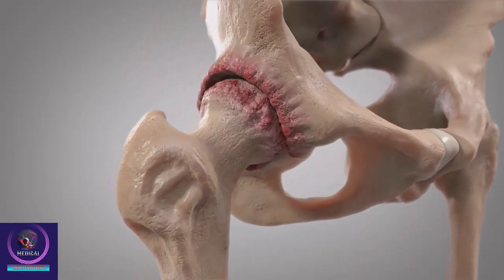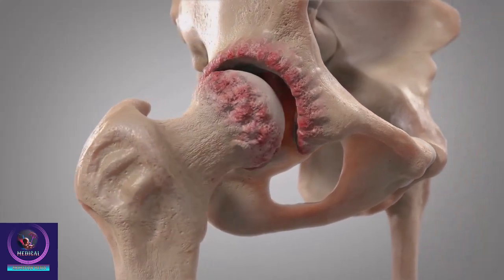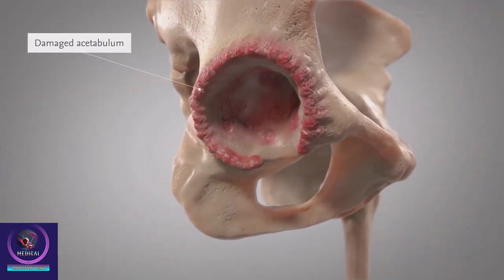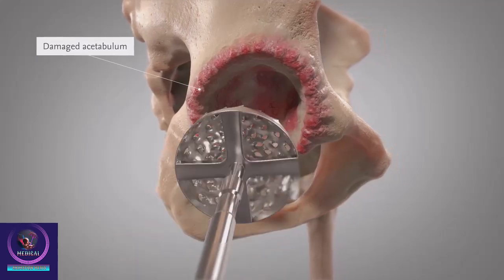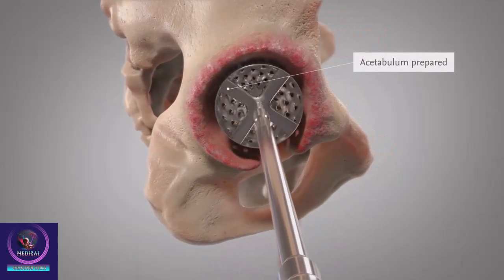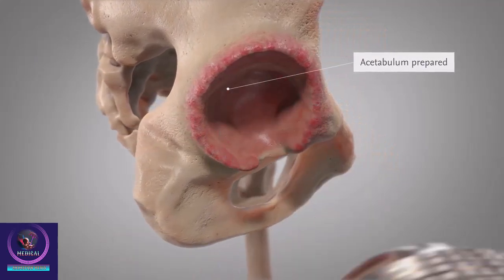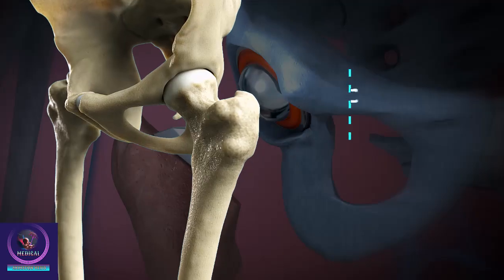A total hip replacement or arthroplasty is a surgical procedure to remove damaged portions of your hip joint and replace them with plastic and metal implants. A total hip replacement can reduce pain and restore your hip function.